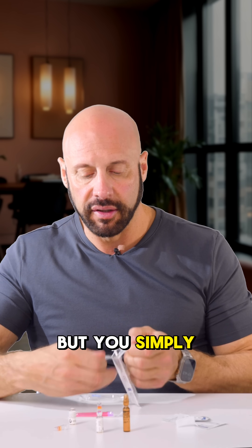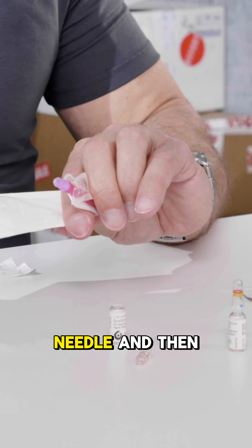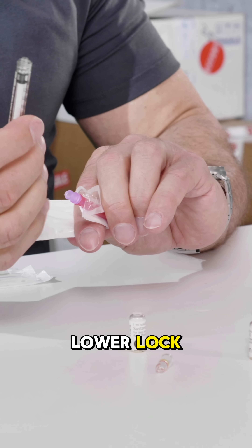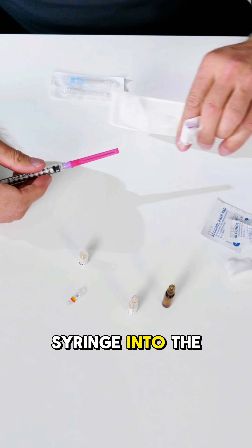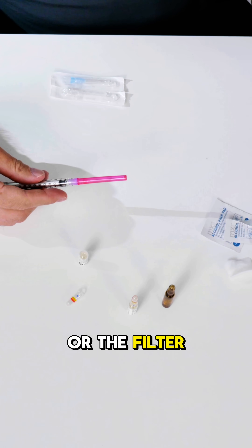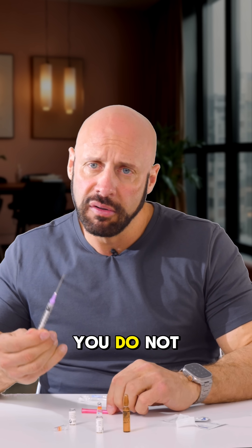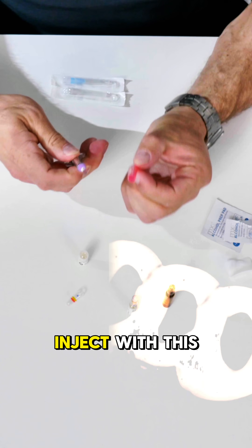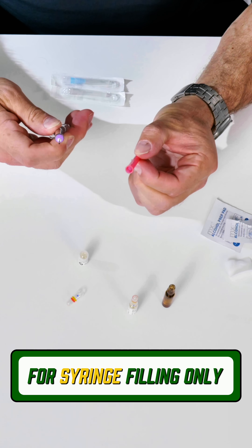You simply open it, open up the 18-gauge filter needle. This is a luer lock, which means the syringe screws in. So I'm going to screw the syringe into the filter needle. I can remove the cap. You do not want to ever inject with this — this is only for filling your syringe.